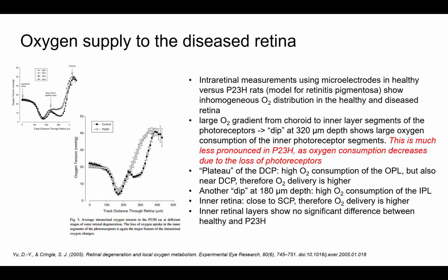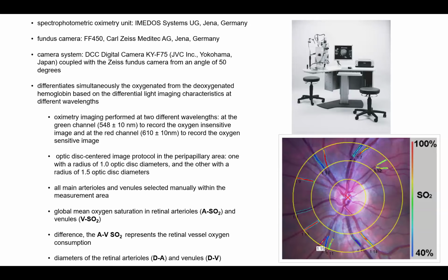Going back to humans, we can measure non-invasively retinal oxygenation using some devices. One of these is the spectrophotometric oximetry, one non-invasive technique to measure retinal oxygenation. And this is a kind of modified fundus photography that can be used in eye clinics after pupil dilation with eye drops.